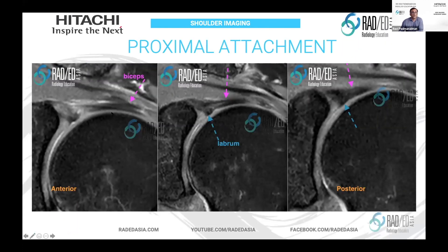So on these coronal scans going from anterior to posterior, the labrum is indicated here — superior labrum — and here's the biceps tendon. Because the biceps tendon curves, you need to follow it on a couple of slices; you're not going to get it in one single slice, you have to follow it on about three slices or so. Here anteriorly we're in the biceps tendon, it hasn't inserted yet. Now we're getting to the insertion into the labrum, and here's the posterior portion where it's at the back end of the insertion site. We have an insertion both into the labrum and into the supraglenoid region.